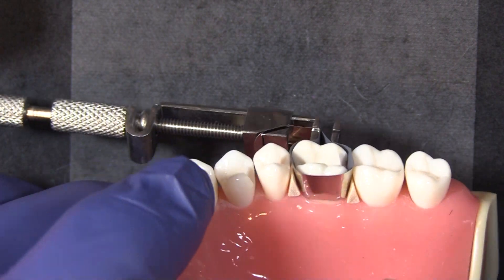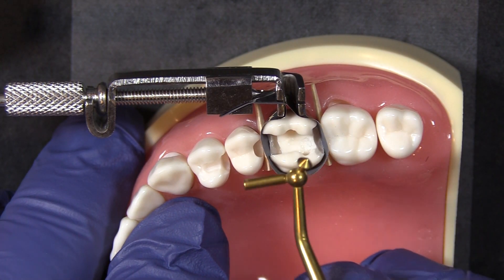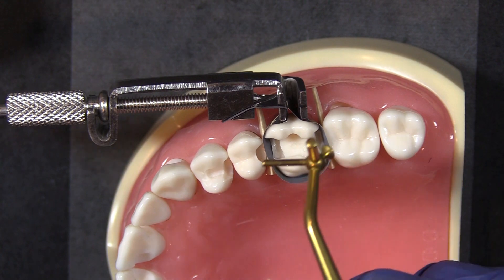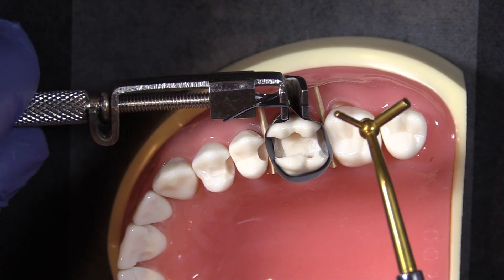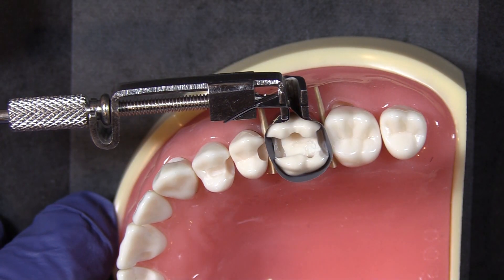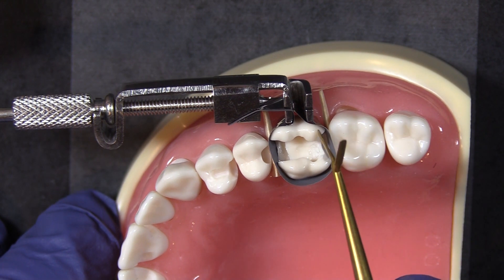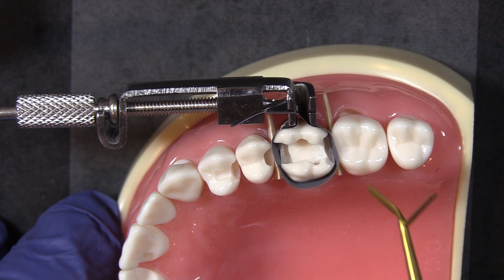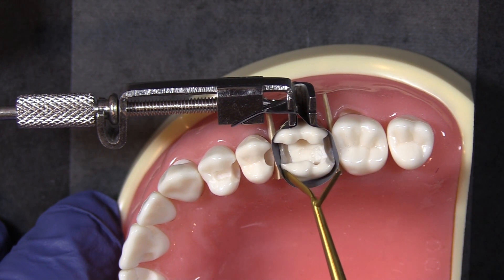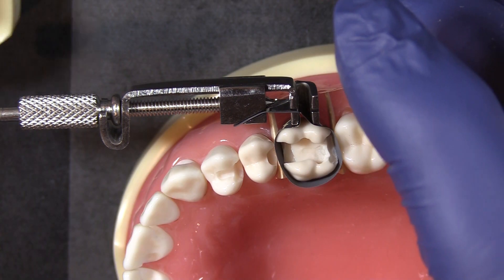In addition, we need to burnish the band — we need to get it in contact with those adjacent teeth. In order to burnish a circumferential band you have to loosen it up a little bit, and as you loosen it you start to open up the buccal and lingual margins around the restoration, creating an opportunity for flash. A little bit more cleanup work involved.